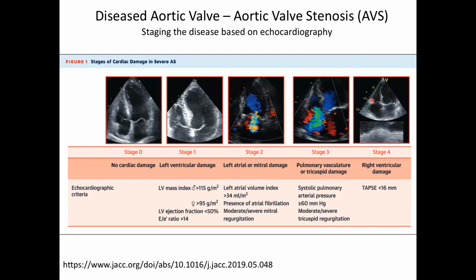And then when the right ventricle itself starts to go down, starts to fade, there is a thing called TAPSE, which is basically just the total amount of motion, if we look here at this valve plane, of this thing going up and down. Okay, that valve plane moving up and down. If that stops moving up and down, then you're in really bad shape. Then your right ventricle is failing.